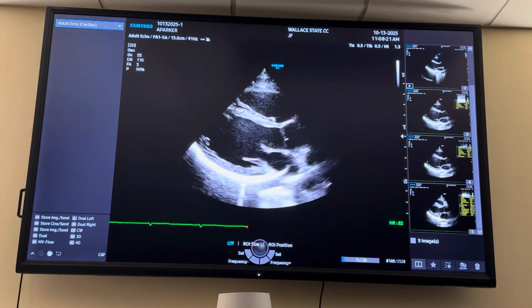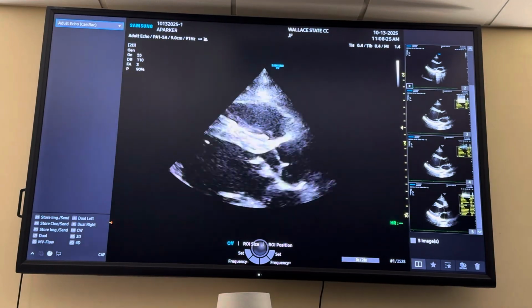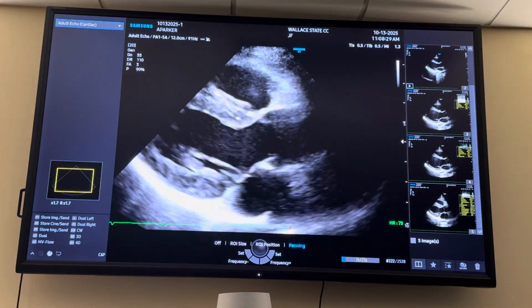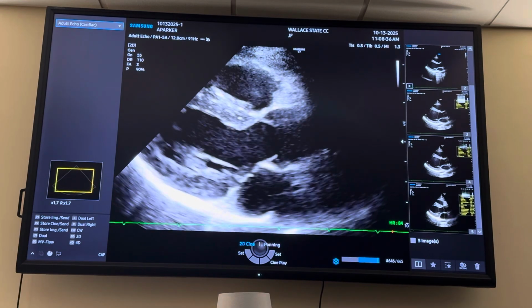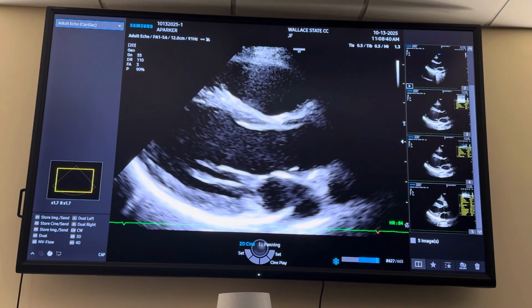So we also have to measure our LVOT. I recommend having it zoomed. While you actually have your image zoomed, when you do your aortic and mitral valve, you very well can go in and do your LVOT. You're going to find, once you start to scan every day in clinic, the routine that you like. As long as it's all included, it's fine.